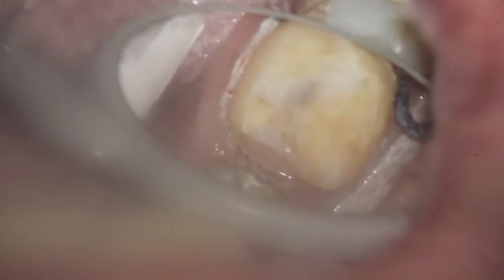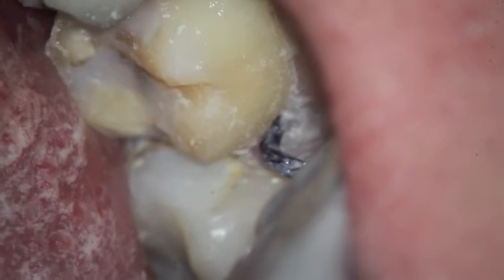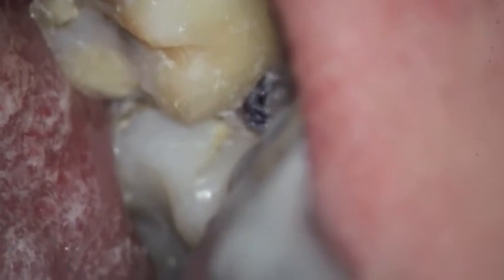This is a patient who came to the office having experienced pain on the lower right side. I'm in the process of putting in a crown after we had removed the fillings and found a crack that was the culprit. And you can see part of the fillings that are there.